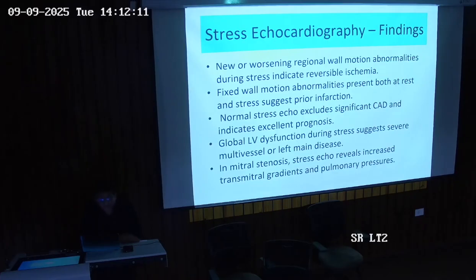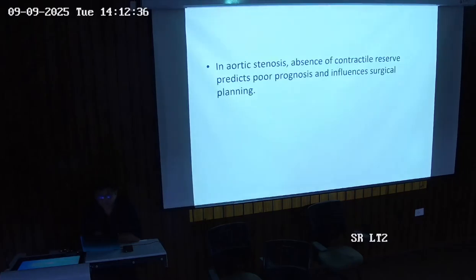Normal stress echo excludes significant CAD and indicates excellent prognosis. Global LV dysfunction during stress suggests severe multivessel or left main disease. In mitral stenosis, stress echo reveals increased transmitral gradient and increased pulmonary pressure. So there are some findings we can detect by stress echo, and accordingly we can manage the patient for cardiac diseases.